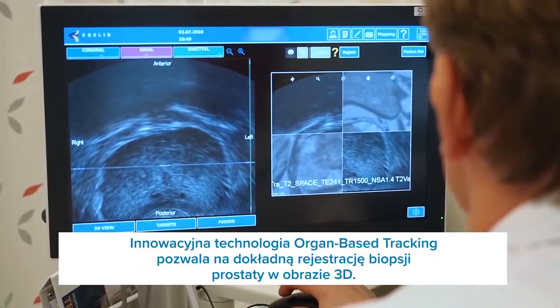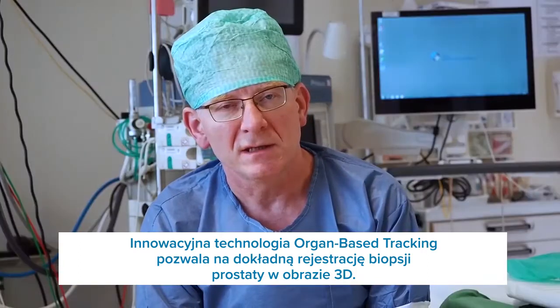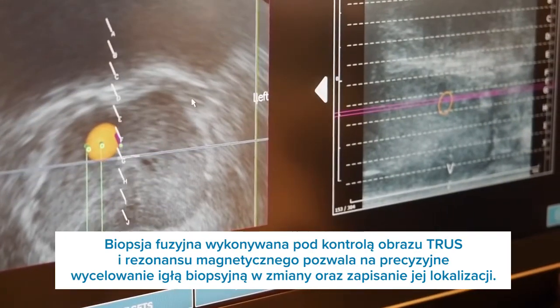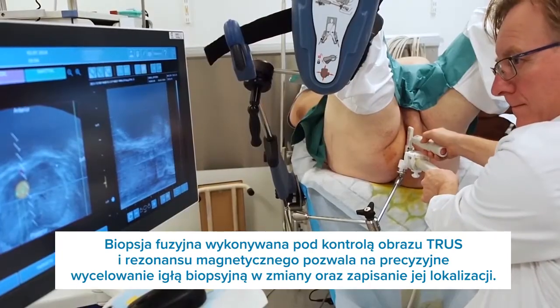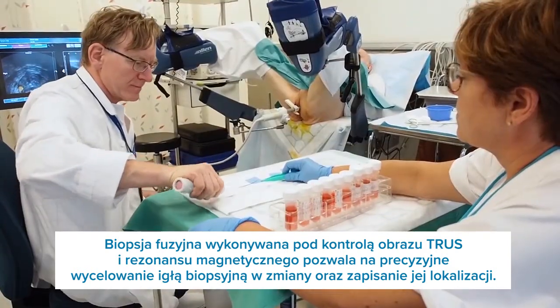Organ tracking allows us to register prostate biopsy very precisely in 3D prostate volume. And using MRI TRUS soft image fusion, we can exactly place our biopsies and document our biopsy location.